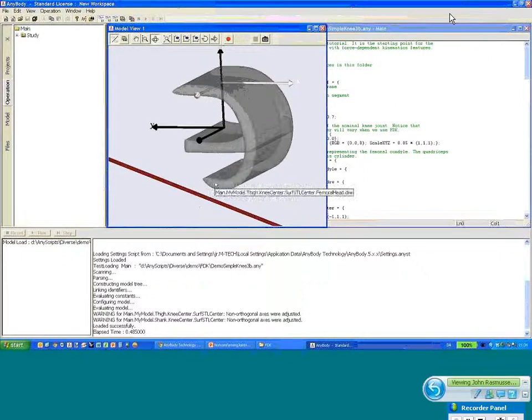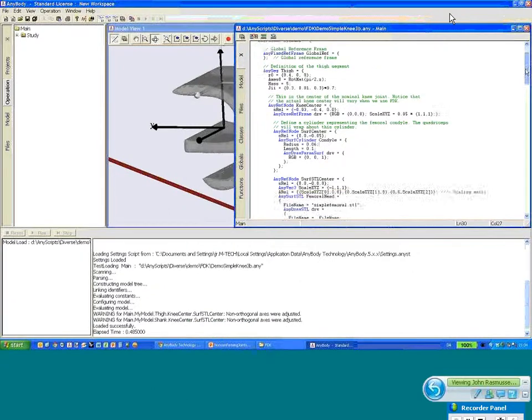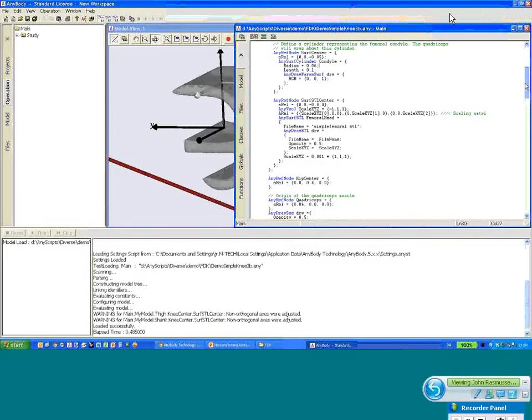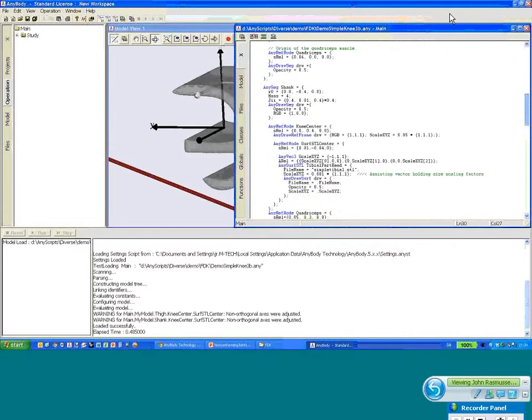And these are structured surfaces. They are made out of STL files, so they can have any surface geometry that you would like. And you can see that there's a little bit of curvature here on the tibial plateau, and that is going to come into contact with the curved surface here on the femoral part. Before we do so, let's just go into the model and see how this is done. So if we scroll down a little bit in the model, you can see many of the same components that we had before.